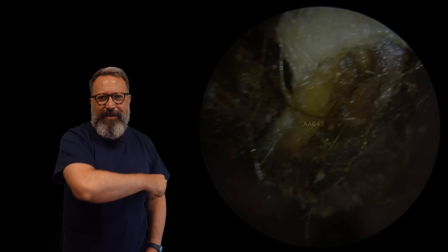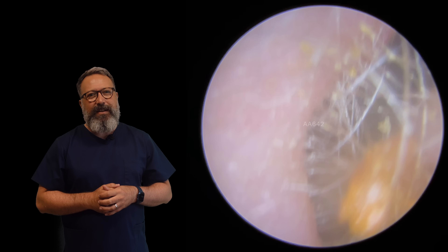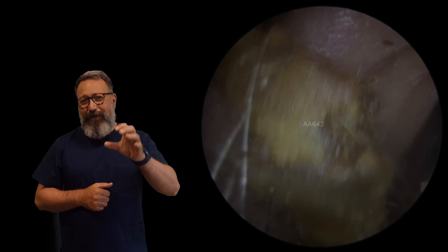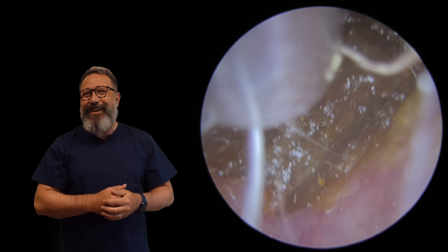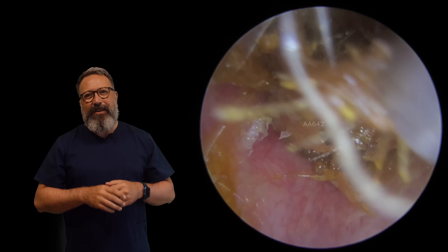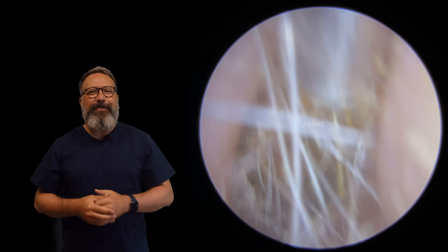Look at that big old chunk coming away — I've actually managed to squish it all together a little bit just to pick it up. Look at the size of that! No wonder this poor patient wasn't able to hear. You can see that lighter material — that dry skin material — a little bit of hair in there for good measure as well, binding everything together. We can just go into the outer part of the ear canal and get rid of this little bit of wax lingering at the entrance. It pulled another big chunk with it. Don't forget, this is coming out of one ear canal — I promise I'm not digging through to the other side. Now much deeper in, we've got this really impacted but thankfully softer wax right down against the eardrum, with little bits of hair, skin, and wax all mixed in together.